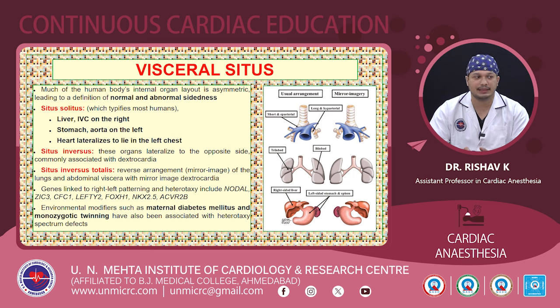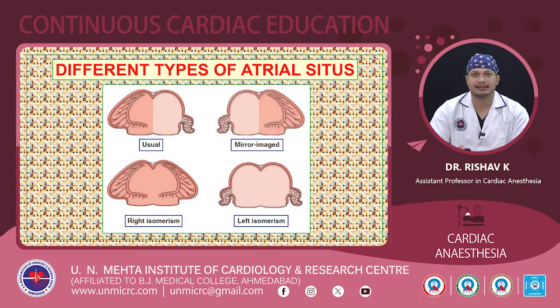So, heterotaxy is quite a complex cardiac lesion, and there are a number of limitations when we get to do the TEE examination of such patients. But using a structured approach, as I will be discussing subsequently, we can examine and determine the anomalies. Now coming to the different types of atrial situs. So this is one of the most important slides.